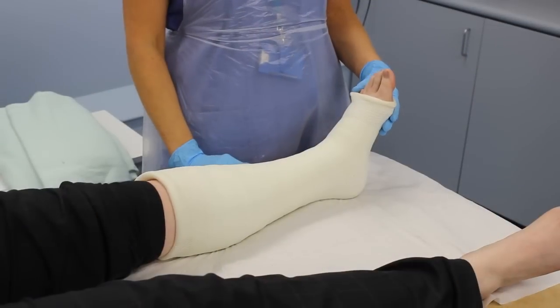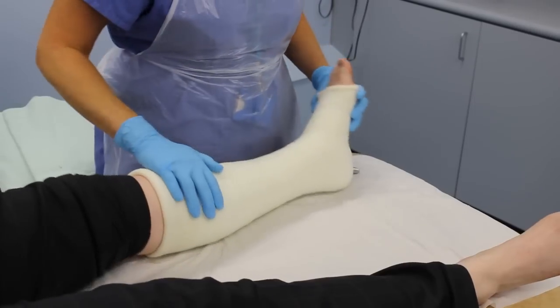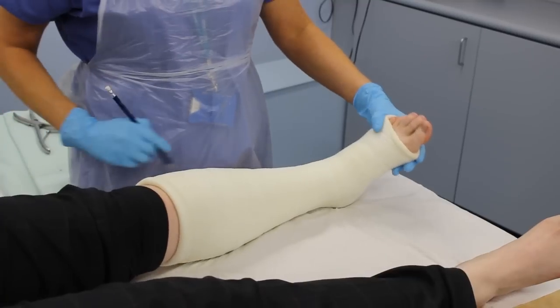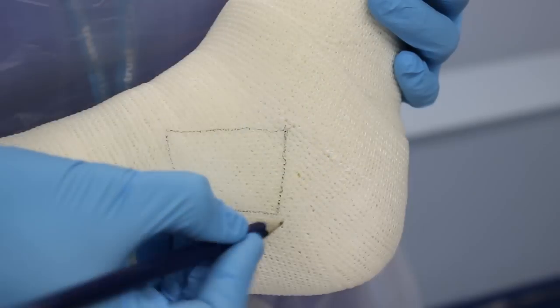Is there any localized heat or staining on any area of the cast? This could be a sign of a blister, sore, or wound infection. Seek medical advice — this may require a window cutting over that area to check the skin.